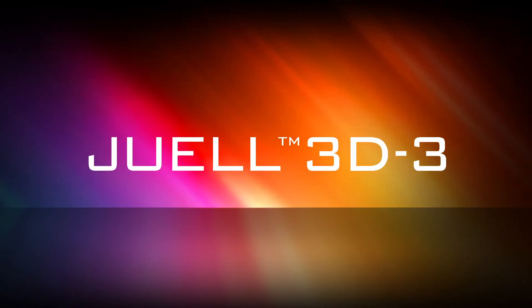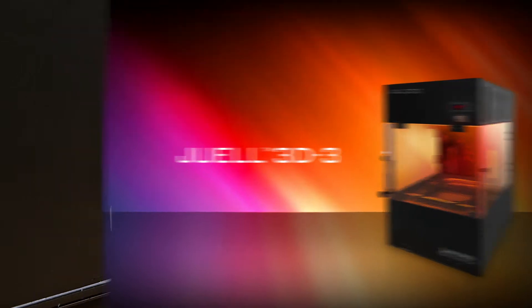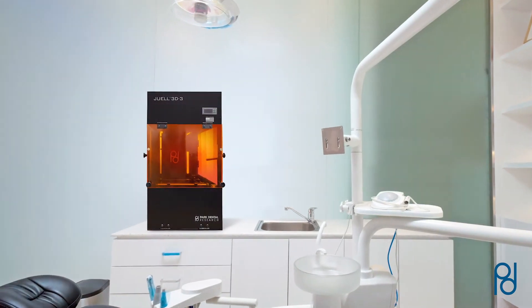Introducing the JUELL 3D-3 printer, designed specifically for high-volume digital dentistry. Created by Park Dental Research, a global leader in dental technology development, JUELL 3D-3 is setting the standard of excellence in speed, quality, and precision.